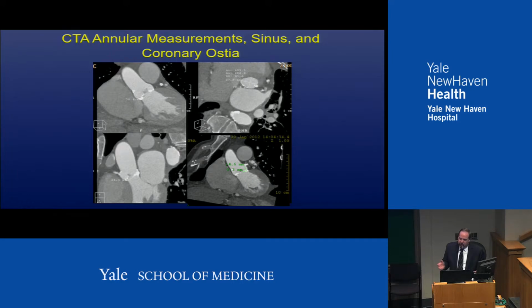And then the standard measurements, as we all do here for TAVR, you know, you can see the calcified cusp, you can see the sinotubular junction. There's a big piece of calcium on the upper left. You can see the area measurements that we do, but there's some in the LV outflow tract. Those are actually risk factors for dissection. And so you want to be careful. You might consider a self-expanding valve versus using a balloon expandable valve. So all of these things are important things.